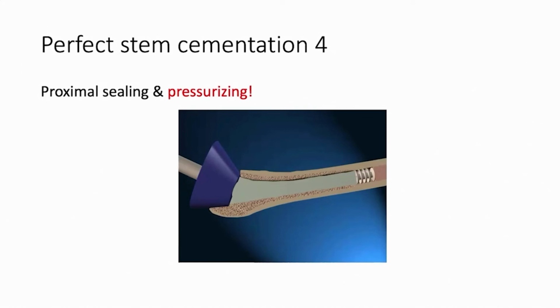So this pressurization moment is important, but I have to say, we'll come back to pressurization in a moment when looking at a different sort of patient. Remember, the patient we're looking at now is a healthy 65-year-old.